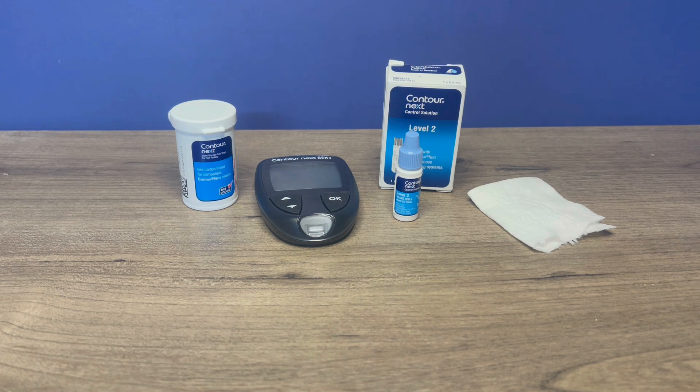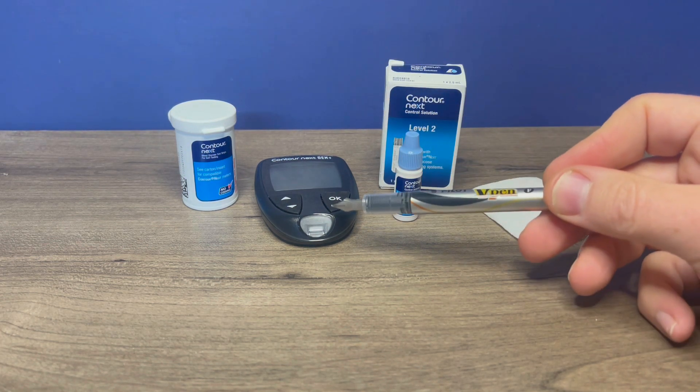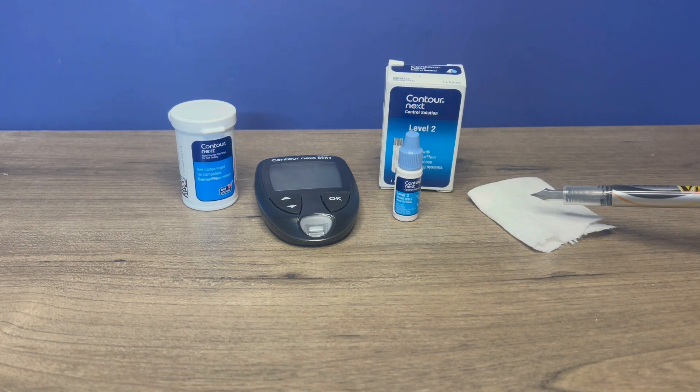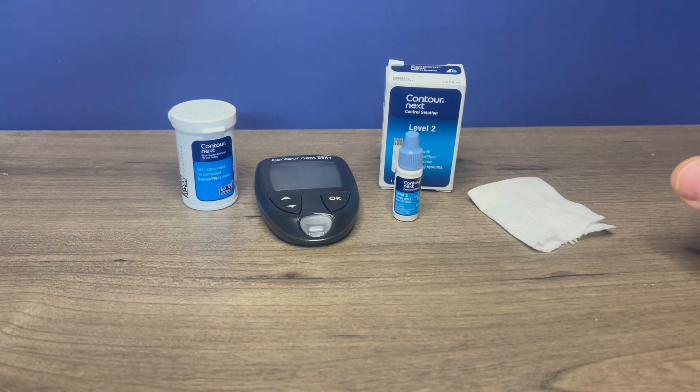So let's perform a control solution test. To do that, you'll need your test strips, you'll need your meter, and your control solution. For this example, I have the level two, and then you want a clean tissue. You'll also need a clean, non-porous surface. For that, I'm going to use the cap on the control solution.